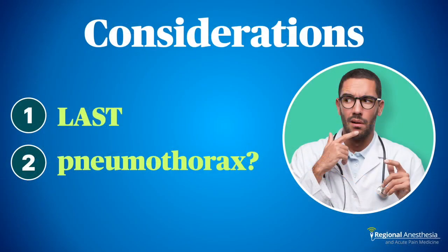There are some things to watch out for with intercostal block. First, this is a highly vascular area, typically one of the ones associated with a high likelihood of LAST. While the actual incidence is apparently quite low, care should be taken with dosages in small patients. Pneumothorax is a risk, but most of the reports come from landmark-based techniques. Careful hydrolocation and slow incremental advancement will ensure you don't drop a lung.